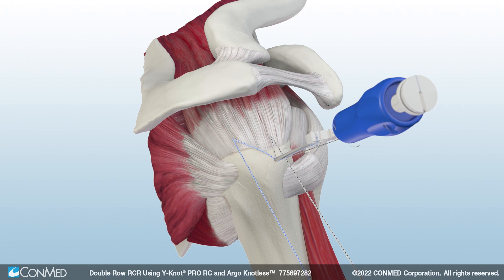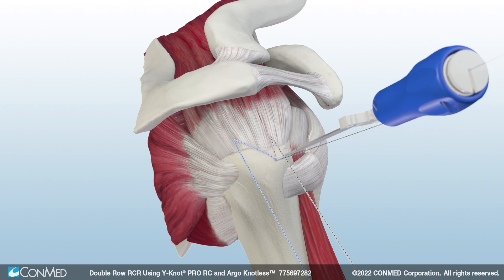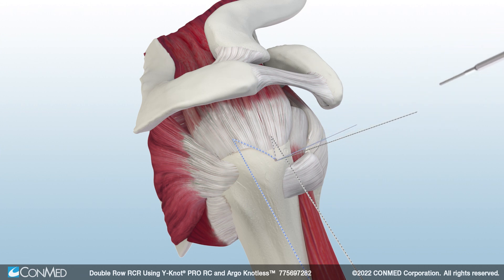Next, un-cleat the sutures from the white suture cleat and also un-cleat the 1mm Hi-Fi Retention Ribbon on the back of the blue handle. Then simply press the quick-release driver button on the back of the blue handle and pull back to remove the driver handle.